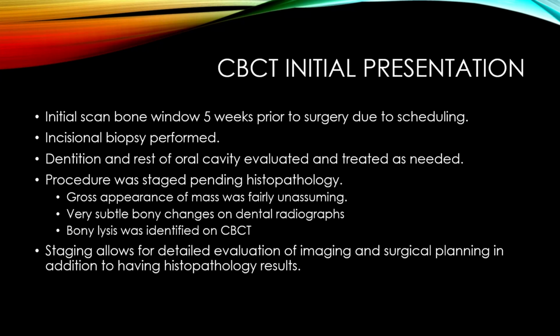The nice thing about staging procedures, and a lot of times we do end up seeing things the same day and doing more biopsy with curative intent type stuff, because it saves time and it saves the client money, or it's financially beneficial. But if you're not really sure what you're looking at, then staging things is obviously the way to go. You can get a histopathologic diagnosis. You can do your imaging and really spend your time to figure out what you want to do, and really plan your surgery. So this was a case that we had histopathology in hand with plenty of time to stage it, and lots of time to look at the imaging and come up with a surgical plan.